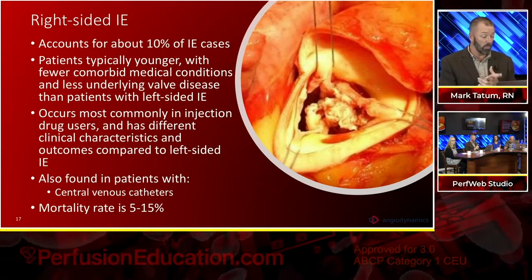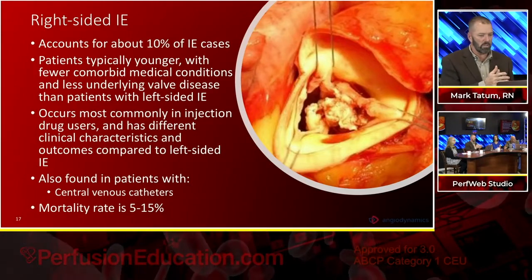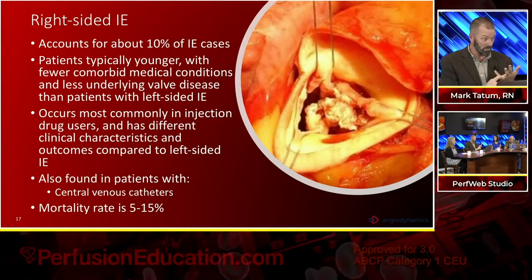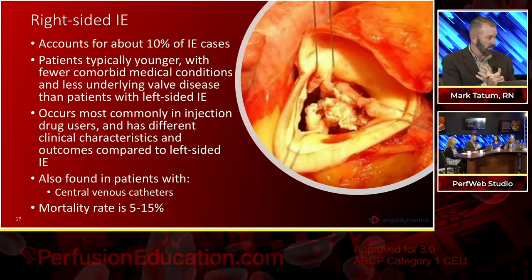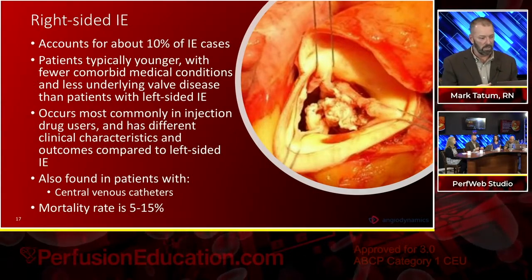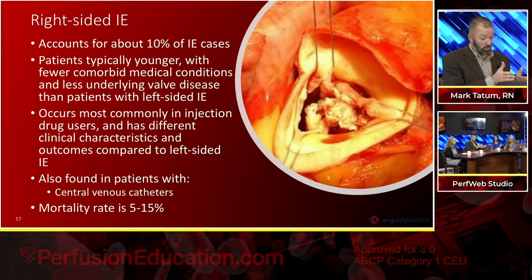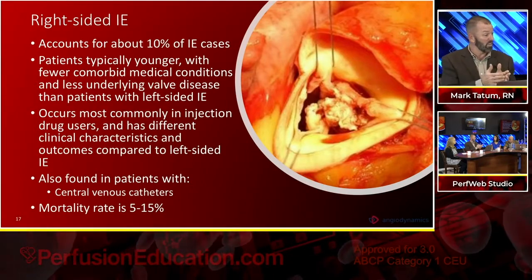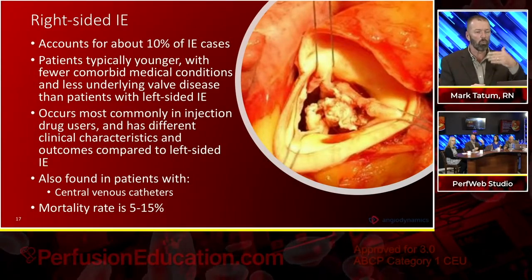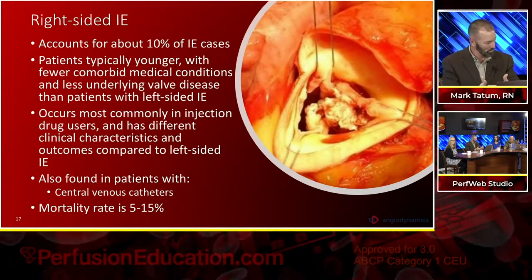One, we see in some cases, and this is case specific, not a claim of the device, patients who are septic, on pressors, intubated, and within 24 hours are off pressors, extubated, with significant relief of their sepsis. We see that in some cases. There are other cases where in the short period of time afterward, the sepsis actually worsened for a period of time before it got better. So we do see both, but it is more frequent that we see a resolution faster than a worsening of the sepsis prior to resolution.